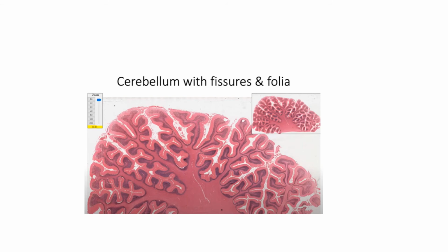Macroscopically, half of the slides you will be able to distinguish. So the first step is, before putting it under the microscope, look at the slide with your naked eye, and then put it in the microscope.